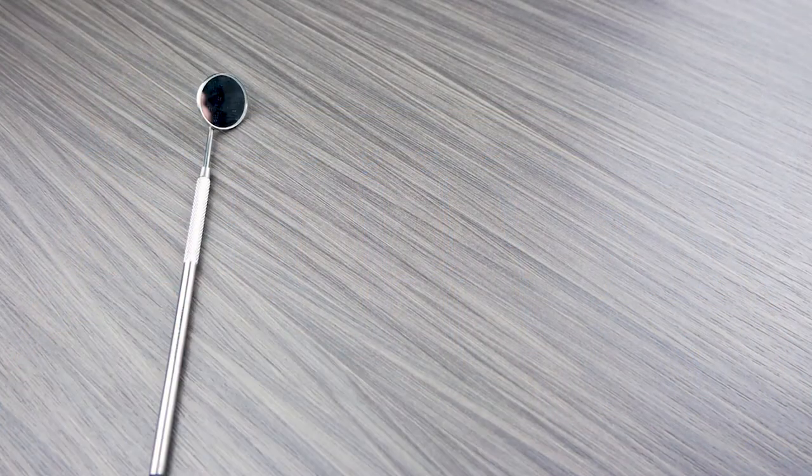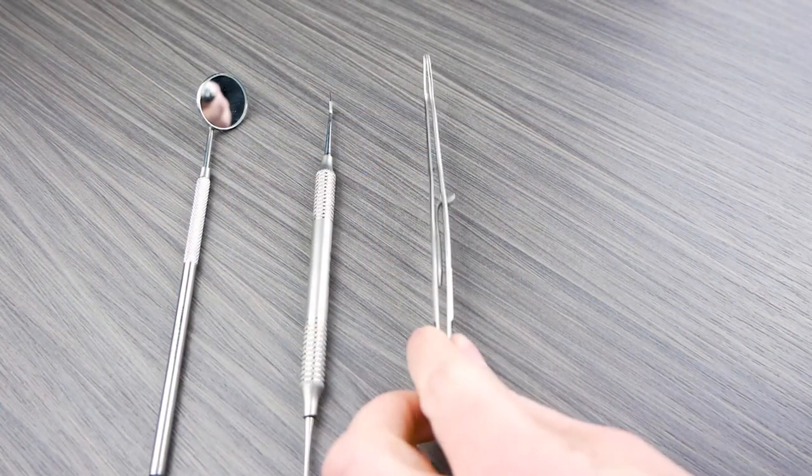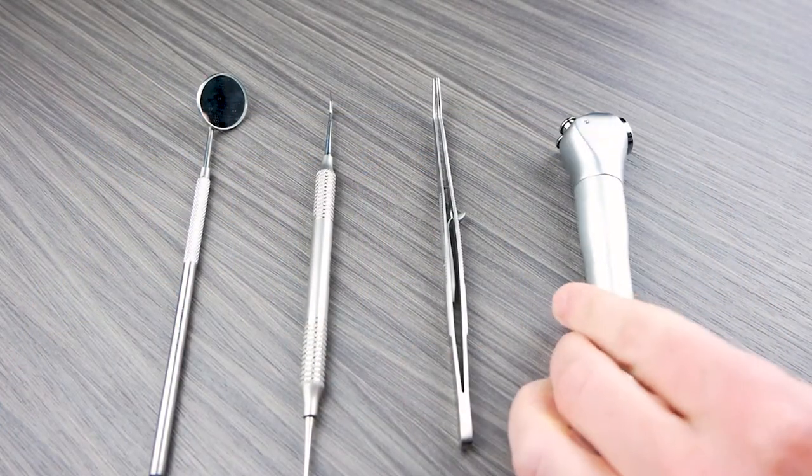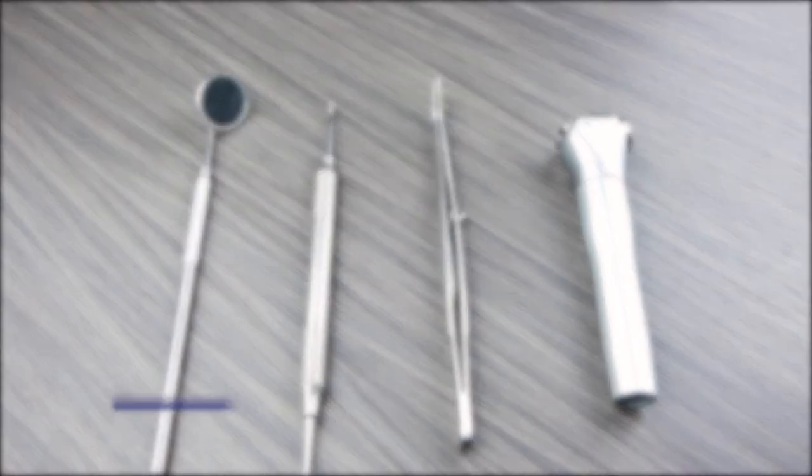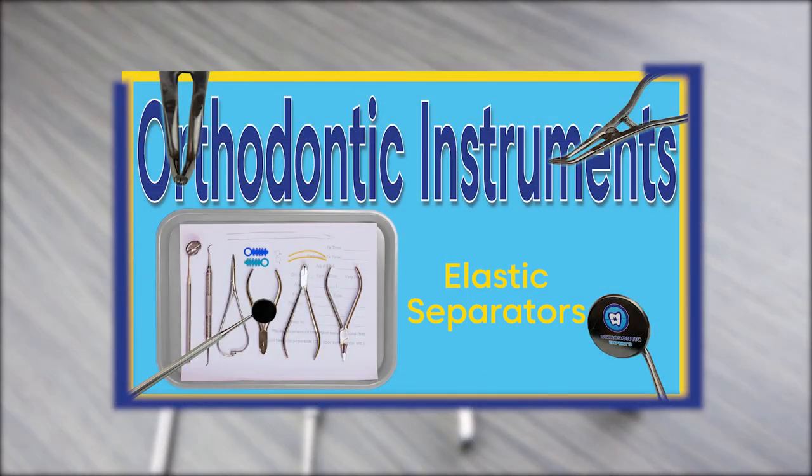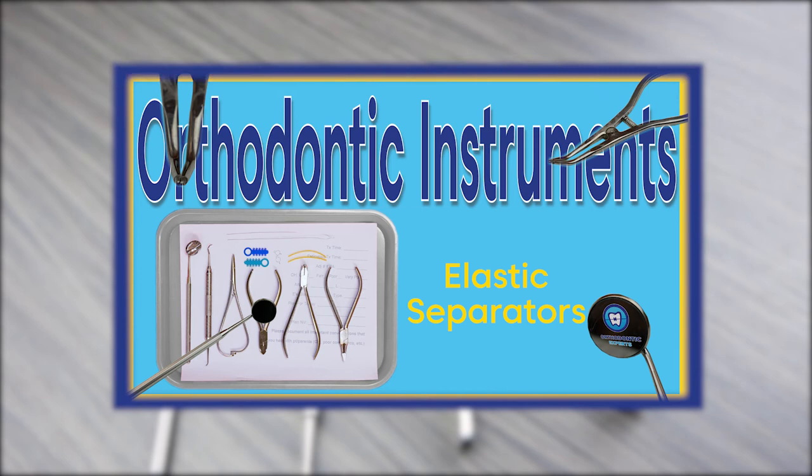To learn more about the dental mirror, probe, cotton pliers, and air water syringe, check out our video on the instruments used for elastic separators.